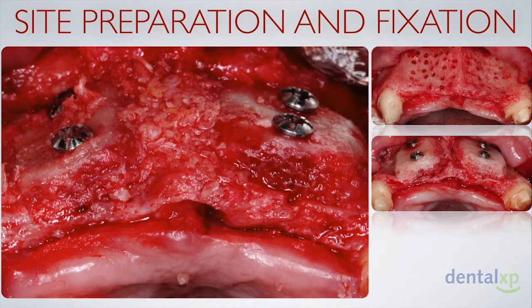Now, what I did notice that was very interesting and I really liked about those blocks is that, provided they're well hydrated, the cancellous portion allows for a degree of compressibility and allows very intimate contact, with a high surface area of contact between the block and the recipient site. Even if the contouring of the block was not perfect, you could see how the cancellous portion is very well adapted and soaks up the blood quite well.